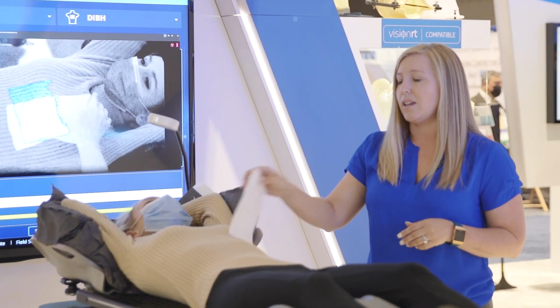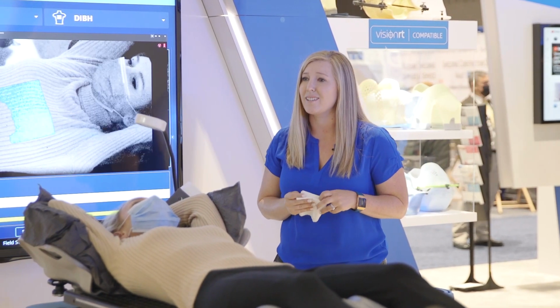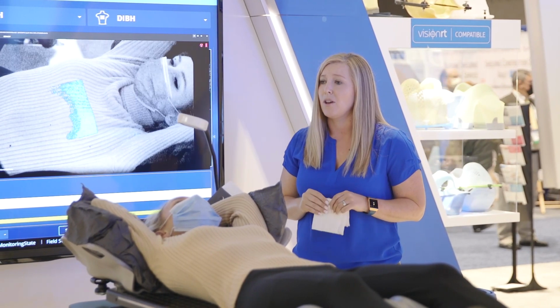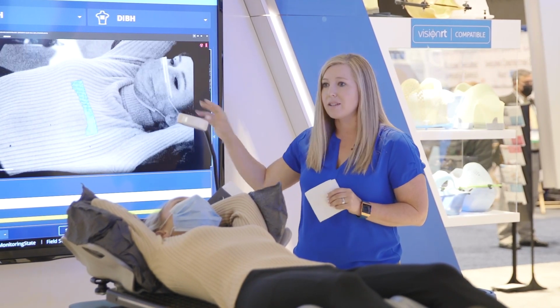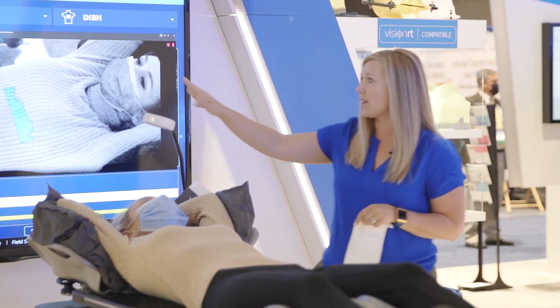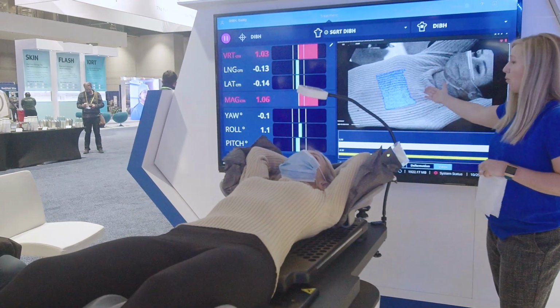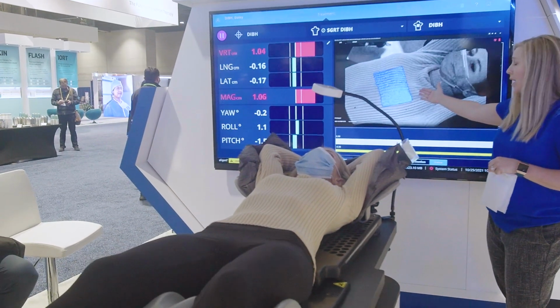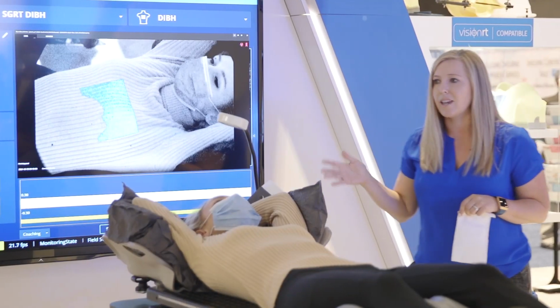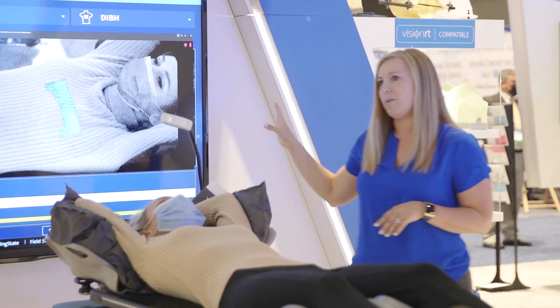There's published data from Dartmouth that they treated 64 patients and in 10% of them, they found errors in their treatment that they were able to stop once they had beamed on because of the Cherenkov imaging. So between our Align-RT system, where we can still watch our patient breathing and make sure they're in the correct position, and DoseRT, where we watch for any kind of inherent error that happens after we set the patient up, it allows us to give the safest and most accurate treatment possible for a technology that's never been on the market before.